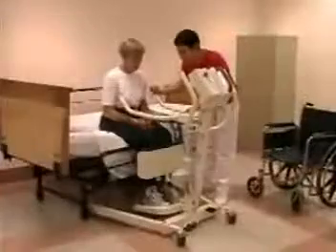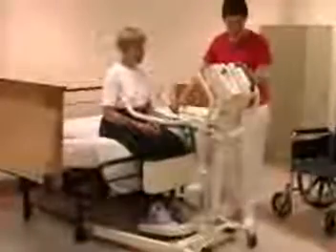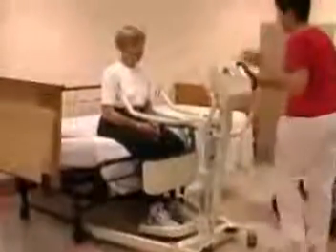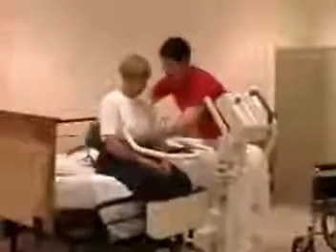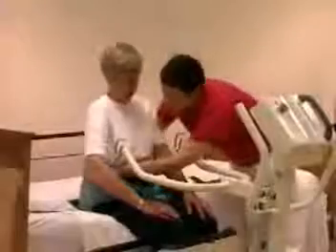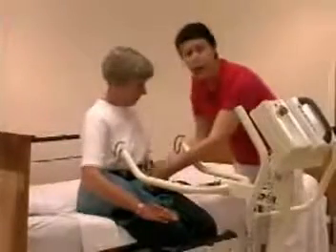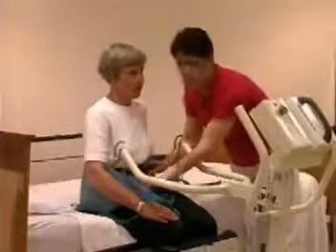I'd like your knees to be comfortably up against this padded area. Okay? And I'm going to lock the base. And then we're going to place this sling around you. The sling has a safety strap. When you're securing the strap, you don't want it to be too tight, just comfortable.